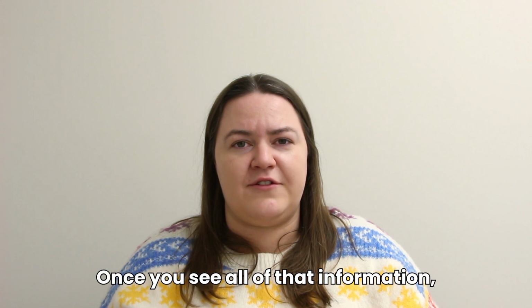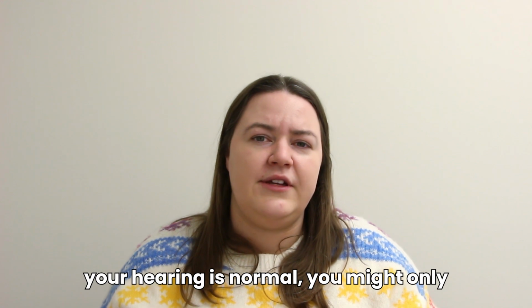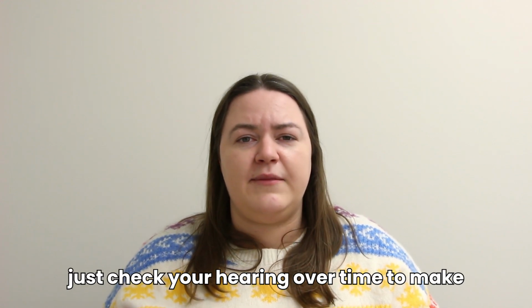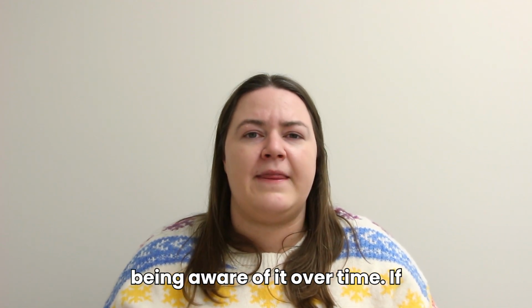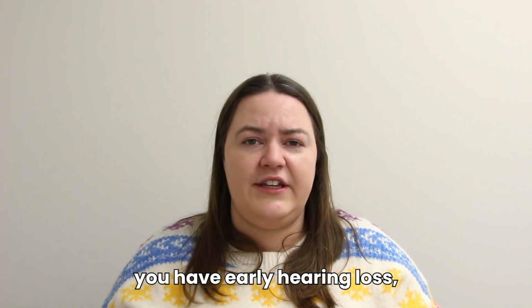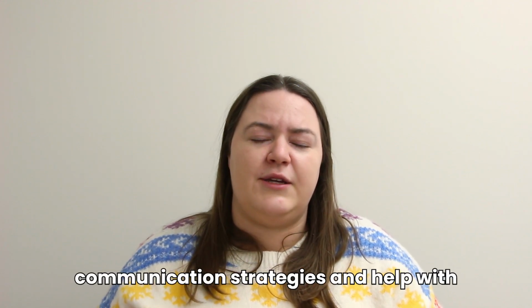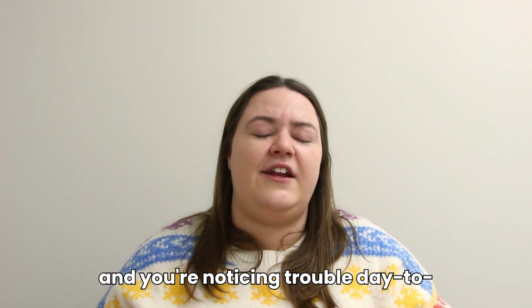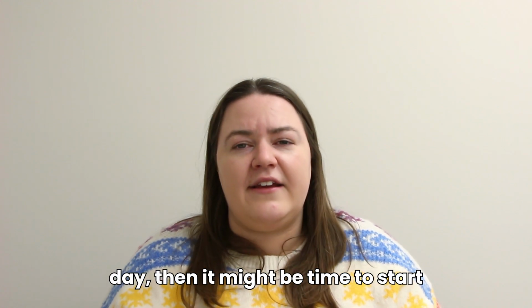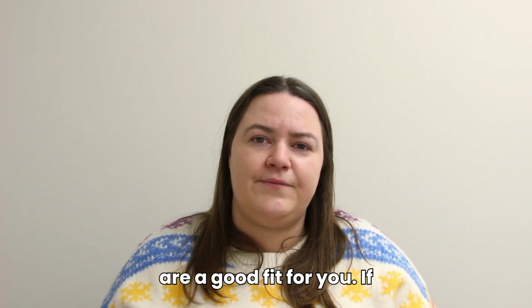Once you see all of that information, it's up to you what to do with it. So if your hearing is normal, you might only just check your hearing over time to make sure that nothing happens without you being aware of it. If you have early hearing loss, you might be thinking about whether or not you're ready to do anything for it, or maybe you just need a little bit of communication strategies and help with that. If you have hearing loss and you're noticing trouble day to day, then it might be time to start considering whether or not hearing aids are a good fit for you.